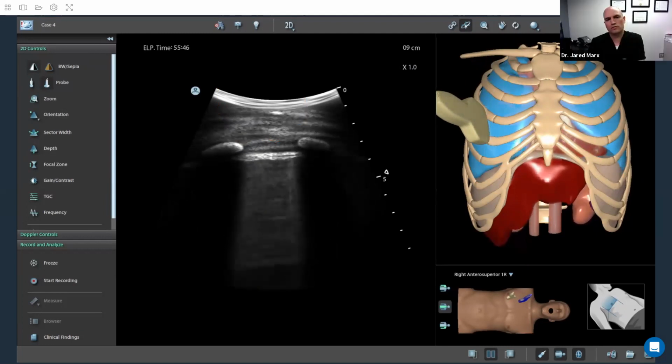I took the images for that comparison before from the moderate disease. This is the module that I borrowed those from, and then I had a severe disease for comparison. So here's their irregular pleural line and the B lines coming along with it. Again, we have our ribs here because the video is moving, but you'll see them and they kind of dip right in there. That is our irregular pleural line, which shows a little bit more advanced disease or more fluid within the interstitium of the lung.